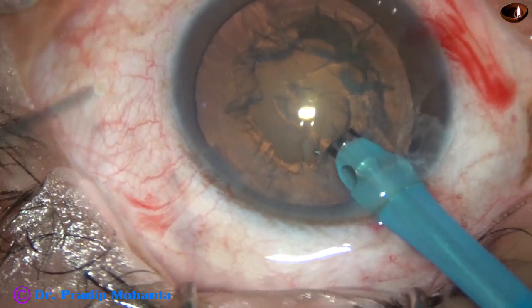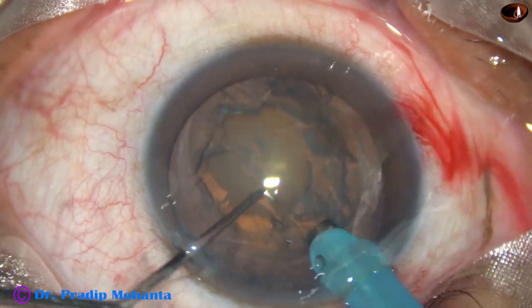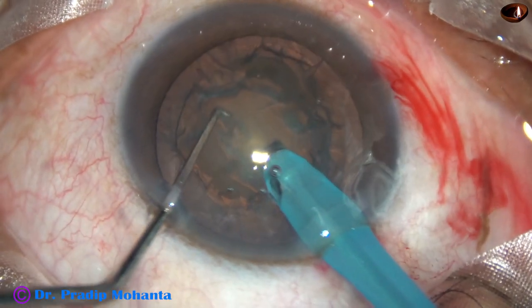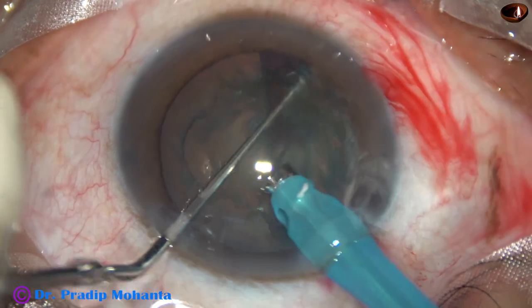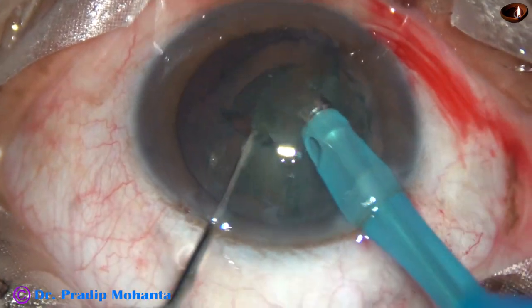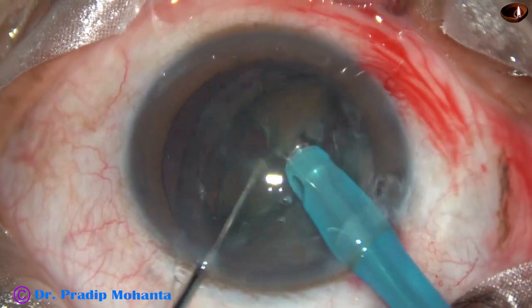This nuclear sclerosis is about grade 2, so we have to be very careful in applying the ultrasonic energy and vacuum. Yes, we could hold the nucleus at the central part and chop it. One free nuclear fragment emulsified.